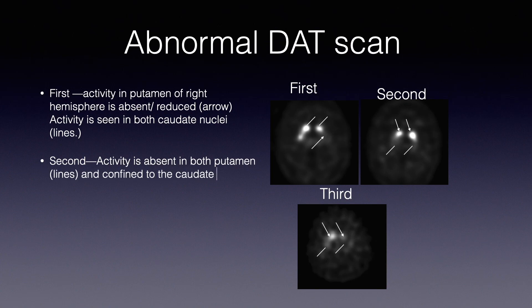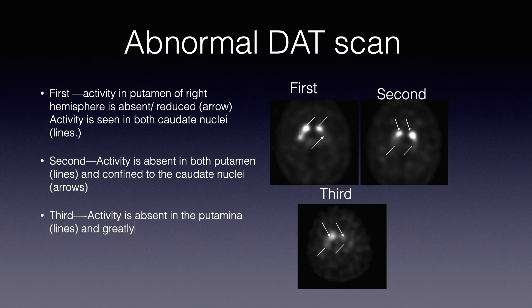In the third image, activity is absent in both the putamen, as shown by the lines, and greatly reduced in the caudate nuclei, as shown by the arrows. The activity is absent in both the putamen.